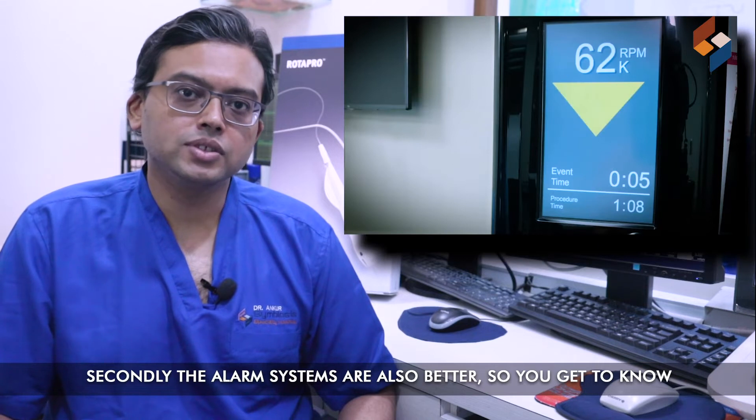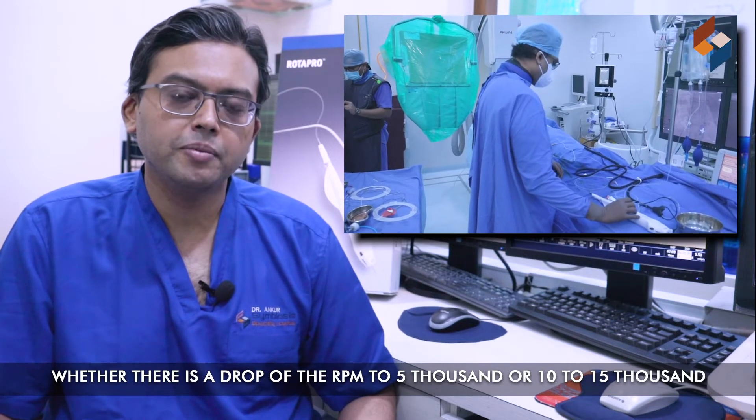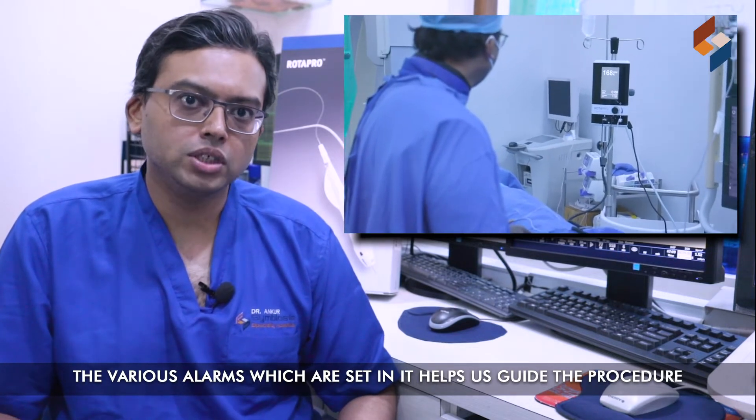Secondly, the alarm systems are also better. So you get to know whether there is a drop of the RPM — 5000 or 10,000–15,000. There are various alarms which are set in, which helps guide the procedure.